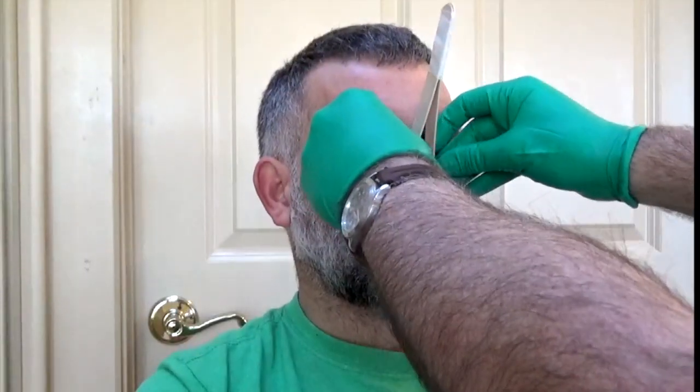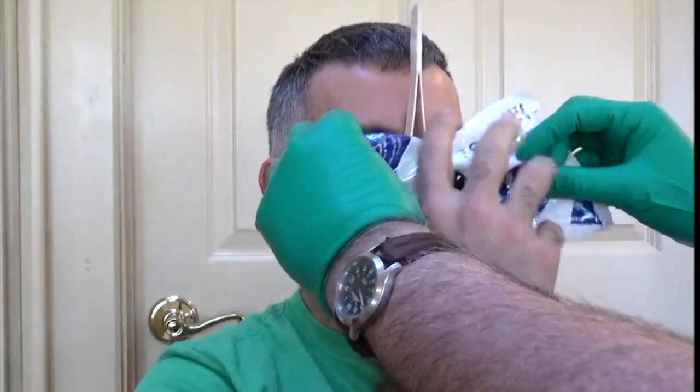Have the patient blow their nose hard, and then put the hemostatic packing in the affected nostril, follow it up with the sponge sticks on each side for a little bit more pressure, and then put on the nasal tongs. If the tongs tend to slip off, you can have the patient pinch them a little bit for extra pressure, and even apply an ice pack if you want. Wait 15 to 20 minutes at least.